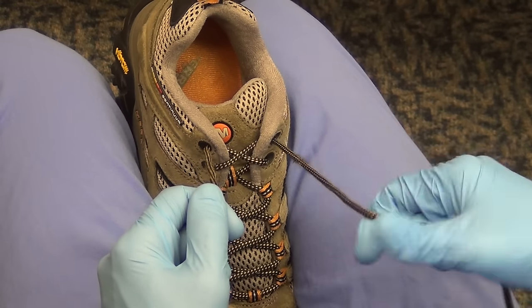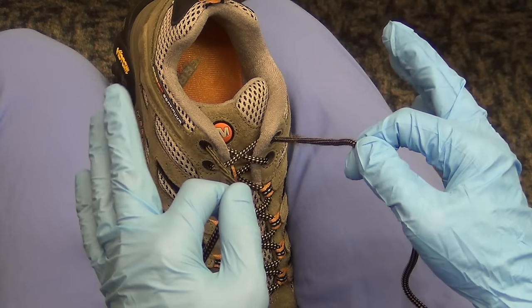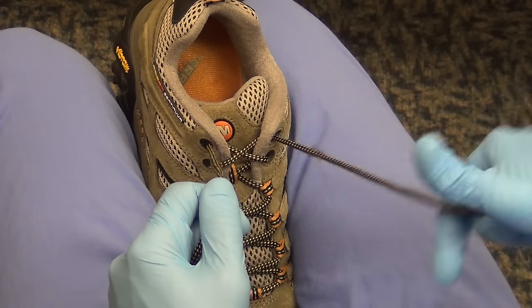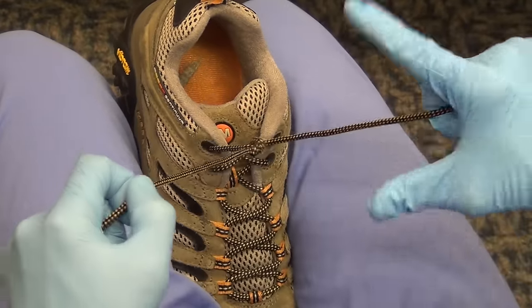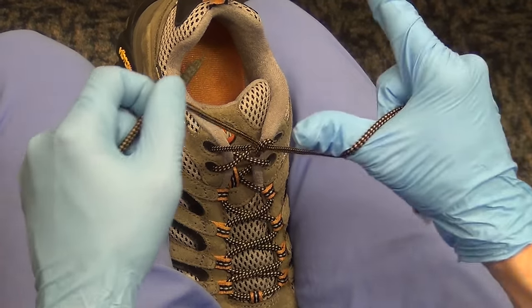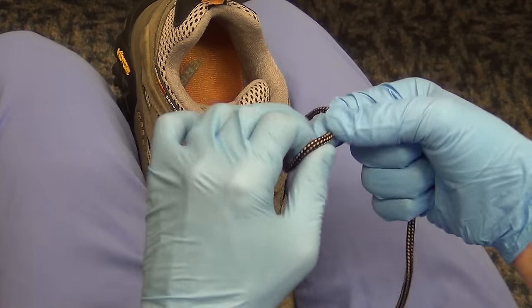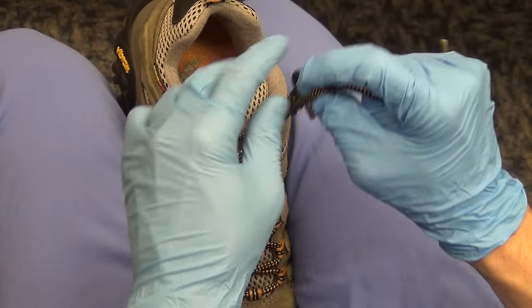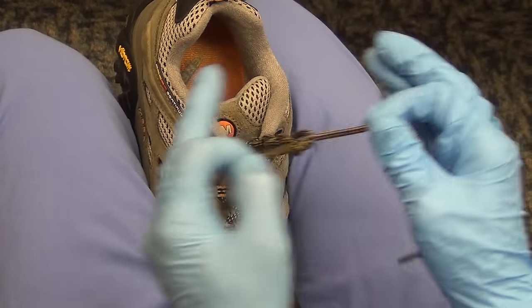Now we're going to practice going back and forth from index finger to thumb. There's one more thing you need to do to tie a square knot which is crossing, but we'll get to that in a second. For now, tie flat knots or granny knots — that's okay — just go back and forth. Index finger, through, down. Thumb, through, down. The more you practice this the faster you're going to get, but maintain good technique. Make sure you're going back and forth from index finger to thumb each time.